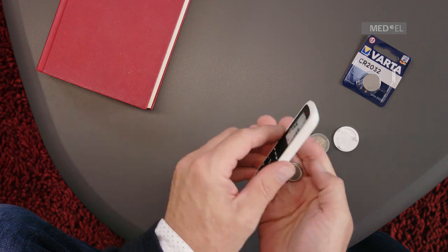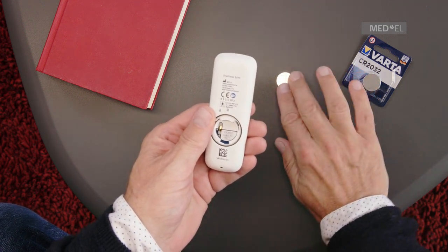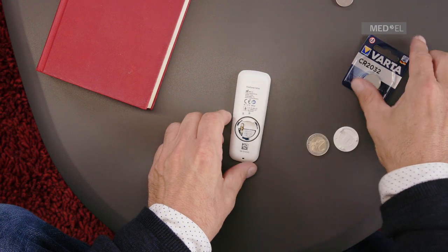Remove the old battery, then insert a CR2032 battery with the positive poles facing upwards.